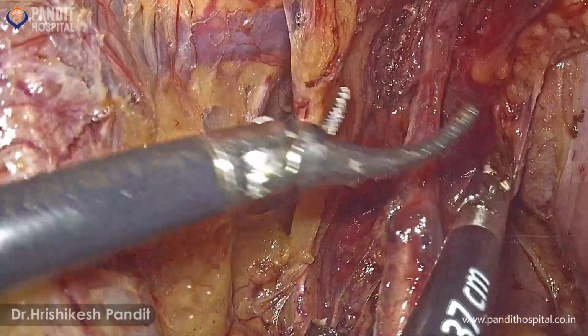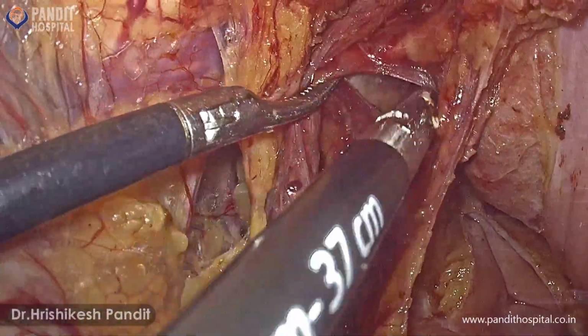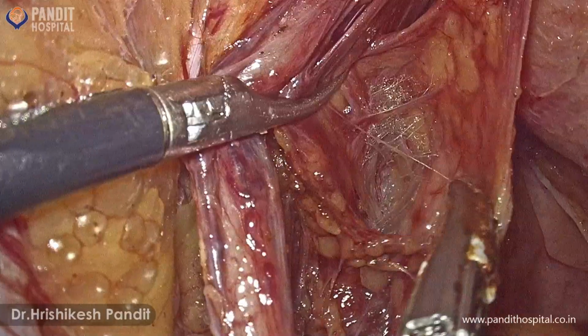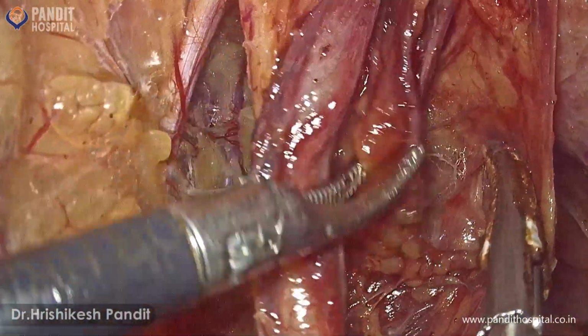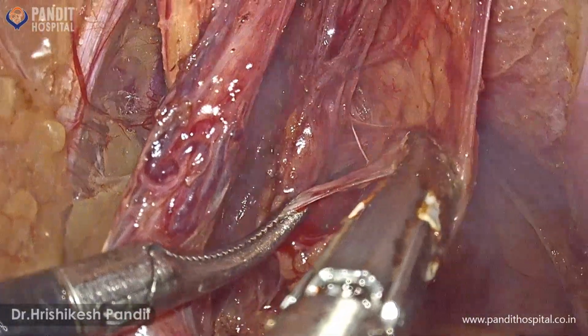We are dissecting medial to the ureter in the medial pararectal space, also known as the Okabayashi space, which contains the hypogastric nerve and the inferior hypogastric plexus. These are to be preserved in nerve sparing type of radical hysterectomy.